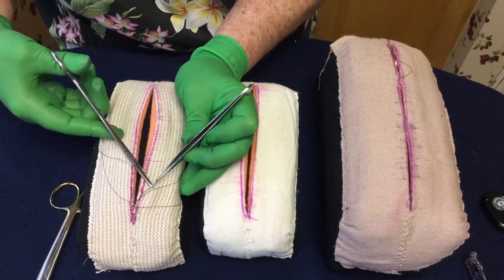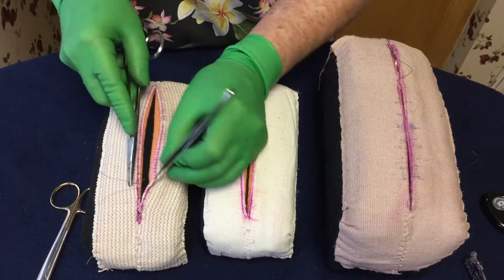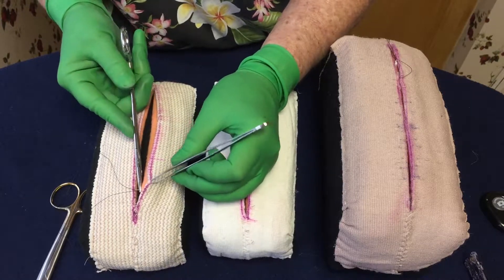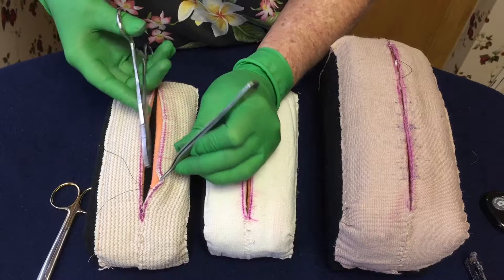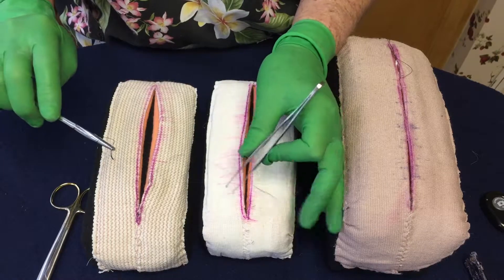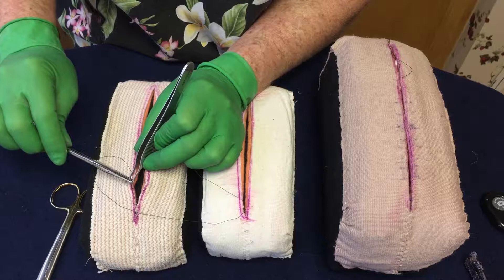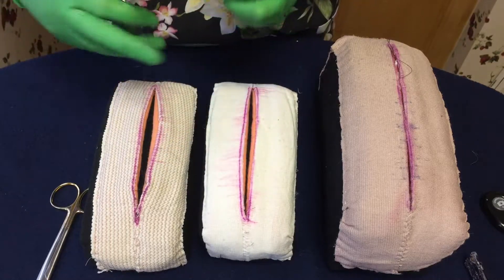When you're doing a deep dermal, the first side is easy — going in here. You can pull this back here or here, lift up. You want to lift up more than you want to lift back, because if you have a fold here and the needle catches it, then you have a pucker. So this side's not bad. On the other side, my thumb's out of it, pull it through, I want to go straight down — I go counter-clockwise to begin with. But if I want a nice big perpendicular bite and a nice good bite of the dermis, I take my needle and push back the epidermis a little bit, and then I can go straight down. Use the back of the needle to help you.